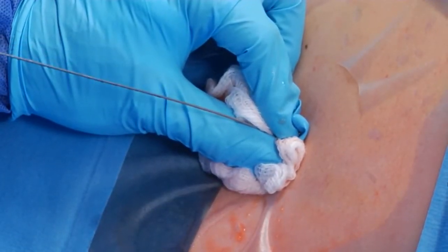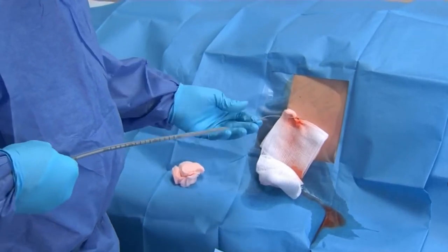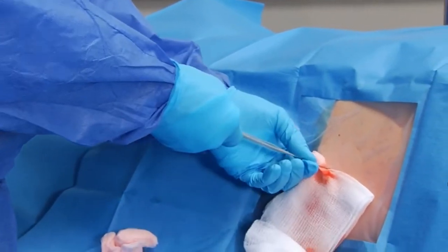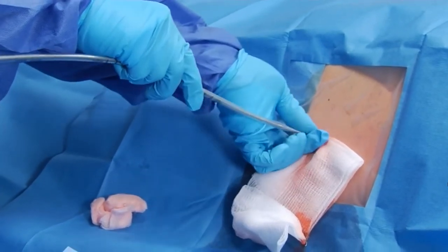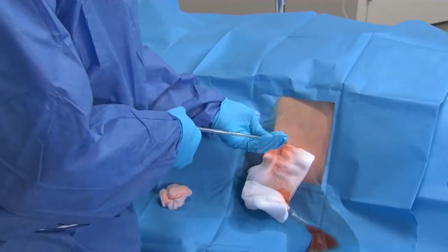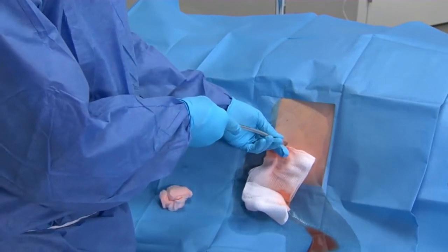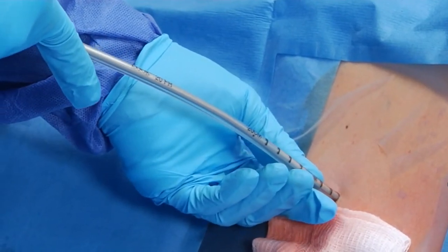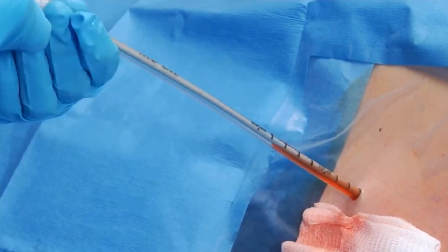With the wire guide still positioned within the pleural space, advance the chest tube inserter chest tube assembly over the wire guide and into the pleural space. If resistance is encountered during the chest tube assembly insertion, determine the cause of resistance and take necessary action to relieve resistance before proceeding. It is important to advance the chest tube assembly into the pleural space in the same line as the wire guide. This will make introduction easier and avoid kinking of the wire guide. The distal end of the chest tube inserter should not be advanced beyond the distal end of the wire guide.